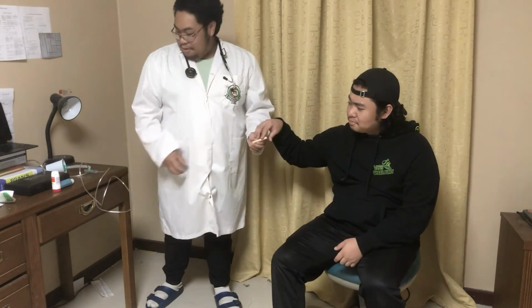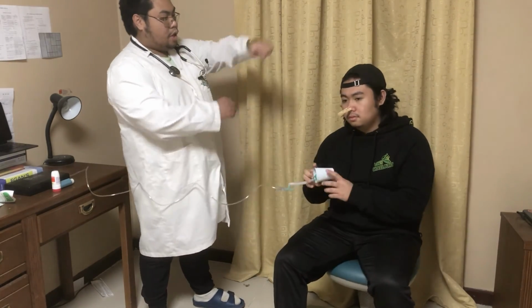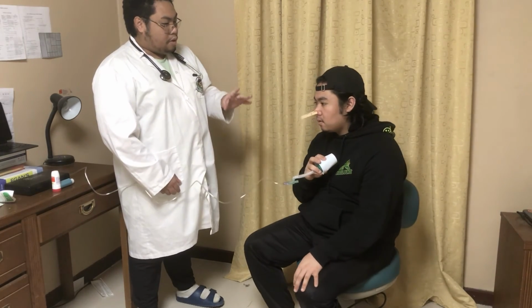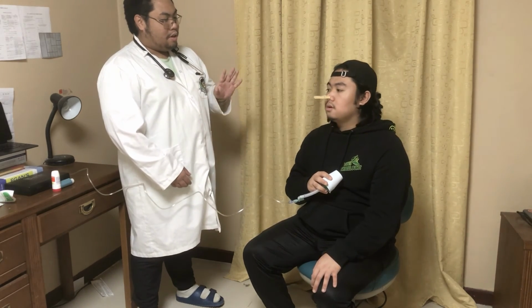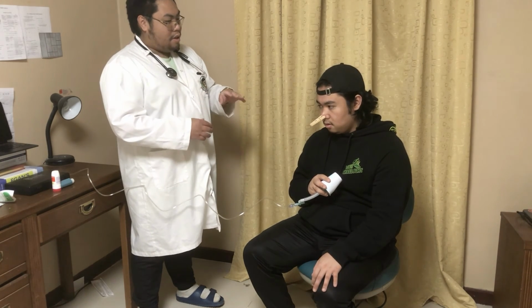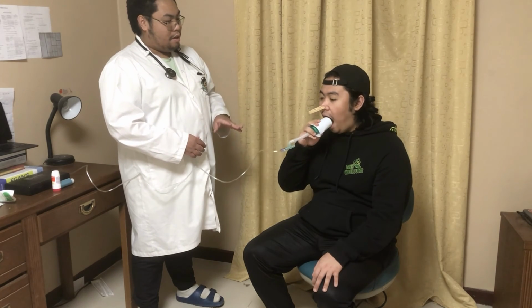So here you go, sir. Your nose clips. And then your spirometer. So sir, you don't put it directly right now. You put it after the 3 normal tidal breaths. Okay? So, inhale, exhale. Inhale, exhale. Inhale, exhale. Put it a little more. Okay? Inhale, exhale. Now, put it in.